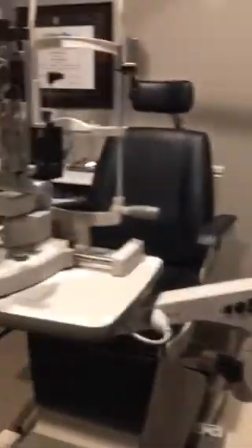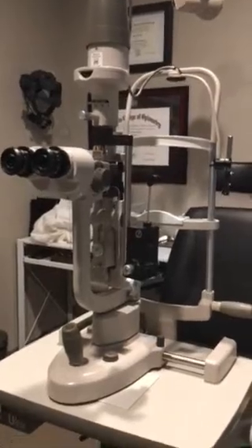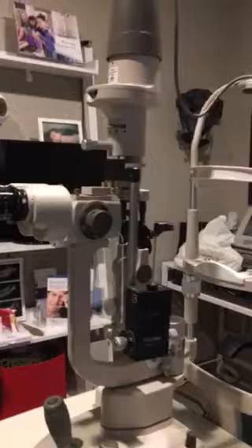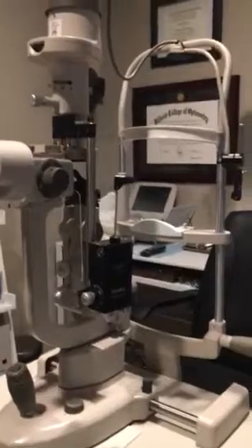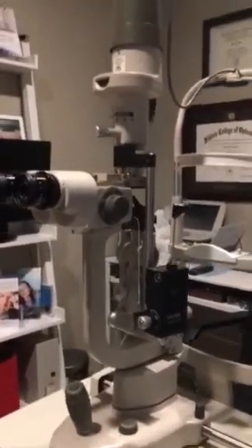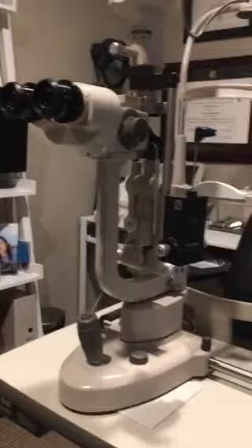Now when you guys come across the slit lamp, it's probably not going to be in this great of shape. Likely you're gonna see a slit lamp in a closet, in a back room, in the emergency department. So just keep in mind that this is something that can be looking different than this. So let's do a quick five-minute tutorial on some of the things that we've taught you already.